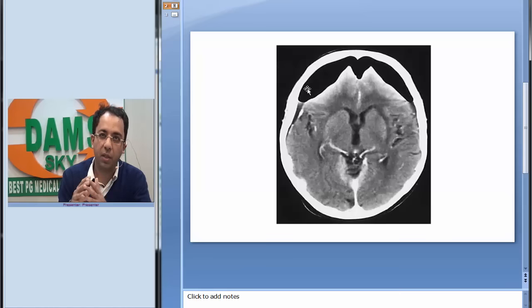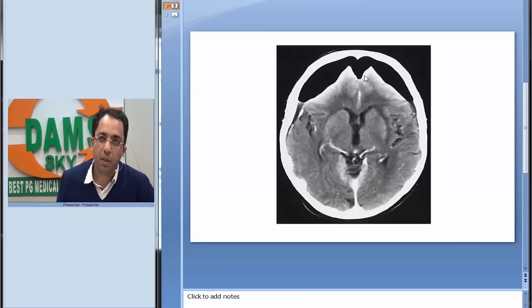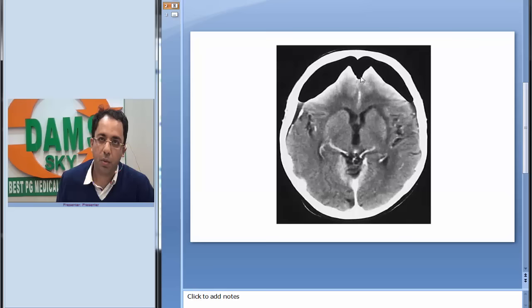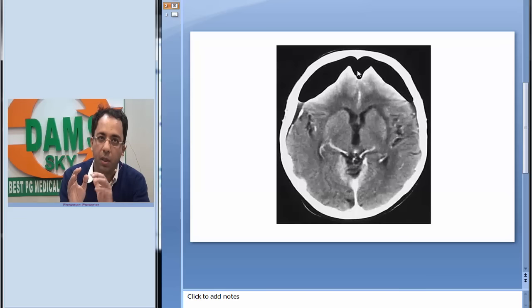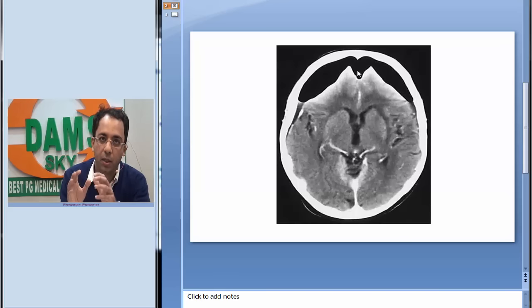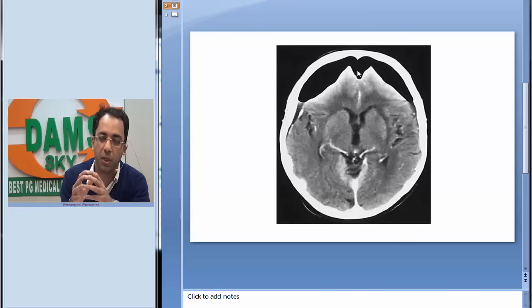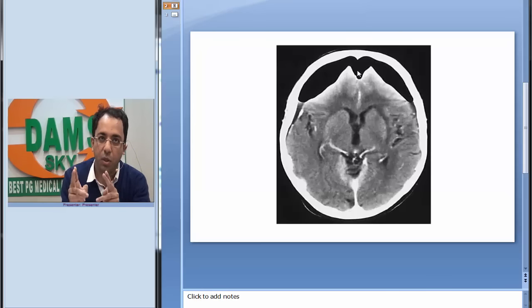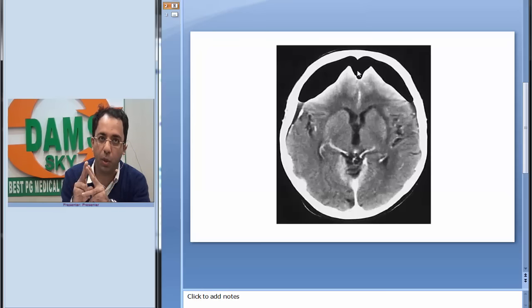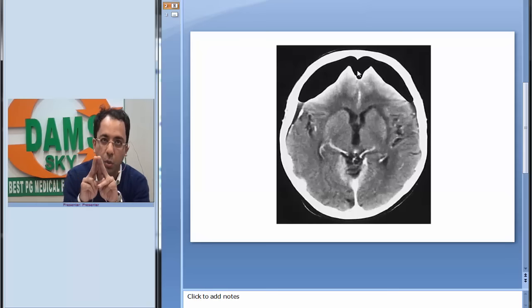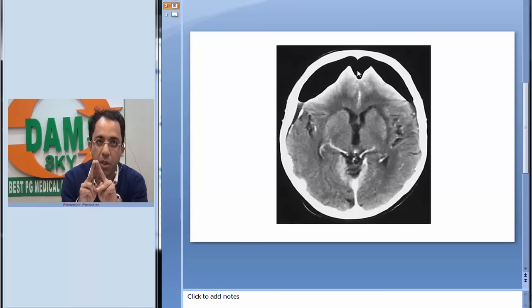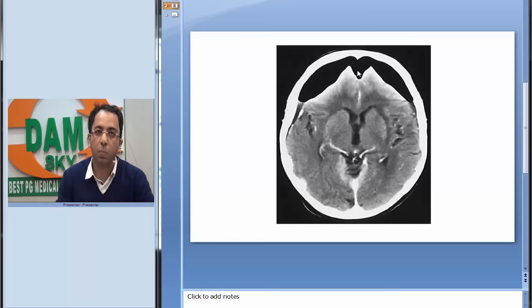What is the finding that you see in this scan which is very typical? You can see the separation of two frontal poles. The frontal poles, the anterior part of the frontal lobes, are separated. Why are they separated? Because the air in this cranial cavity has pressure more than the surface tension of the CSF, which normally holds the two frontal lobes together.